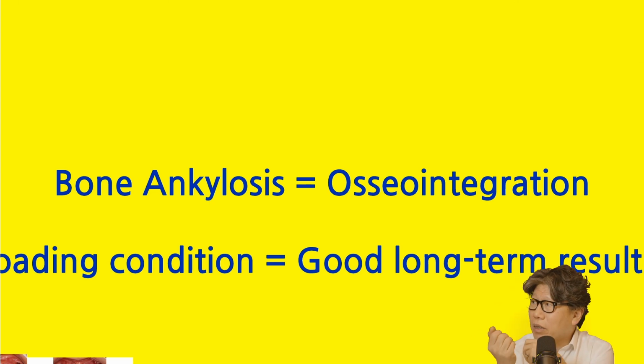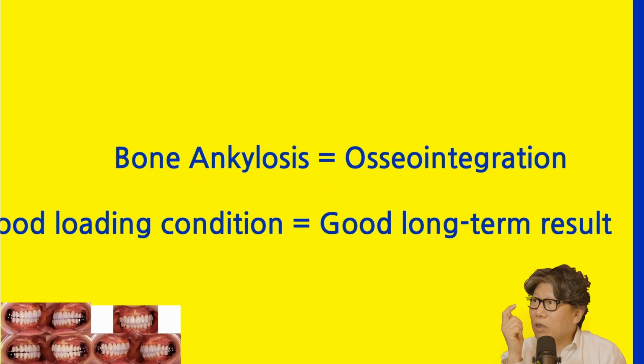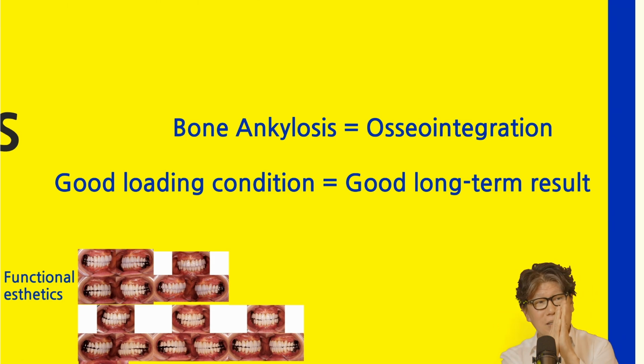That's how I would describe it, but if you think that osseointegration is going to attach something at the molecular level, you're really wrong. You can't think of it that way. So it's really less about the bone ankylosis concept and more about the intimate contact. And the situation where the intimate contact is slipping and falling off, like this is a loading condition problem. If the force on the implant is not up to that, the implant stays in. That's the accepted wisdom. That's the current understanding.